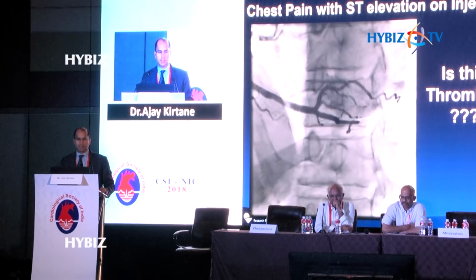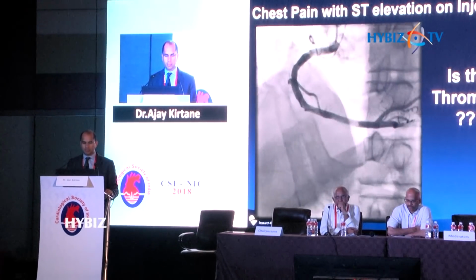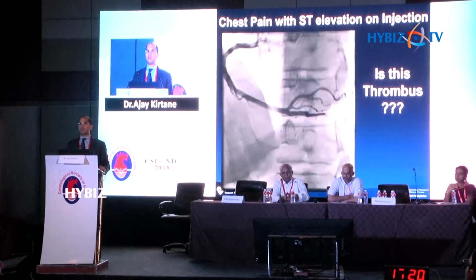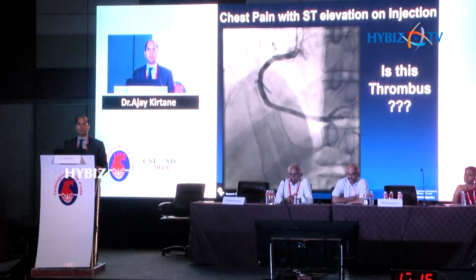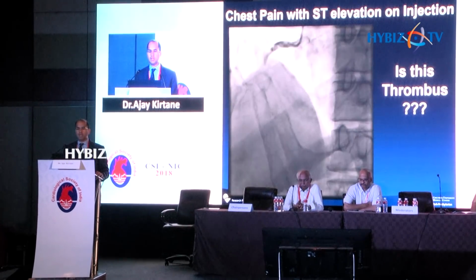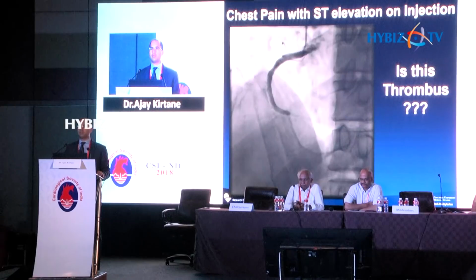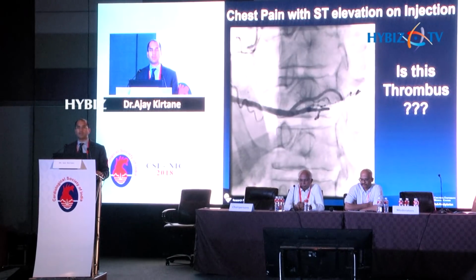This patient had chest pain with ST elevations on injection, and I think you can appreciate down here there's this washout filling defect thing that's sliding back and forth in the vessel. Because the patient had chest pain, the operator got very, very concerned for thrombus, started the patient on a 2B3A inhibitor, transferred the patient to another facility, and opted to do PCI, ultimately did imaging and did not do PCI. Fortunately, the patient had some other issues going on, and the patient came to me for a second opinion.